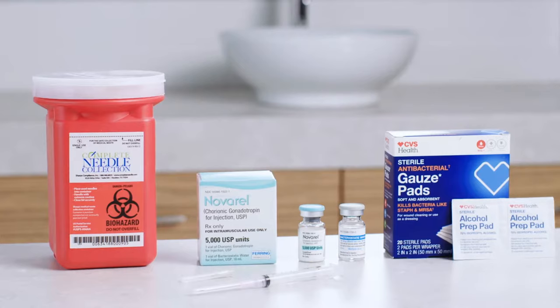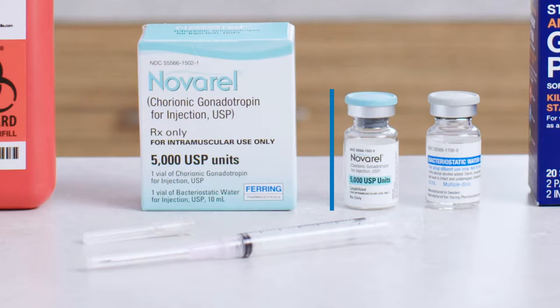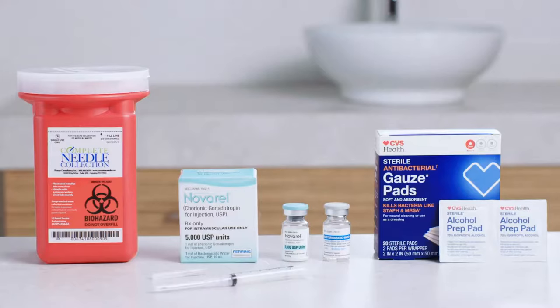Let's start by making sure you've got all your supplies ready to go: a vial of Novaral 5000 IU, also known as HCG; a vial of bacteriostatic water for diluting; a sterile syringe; a mixing needle, which may or may not arrive attached to the syringe; an injection needle; alcohol pads; sterile gauze; a sharps container; and a clean surface.